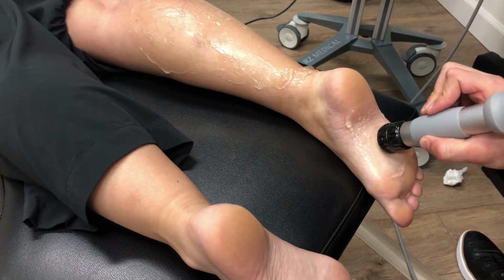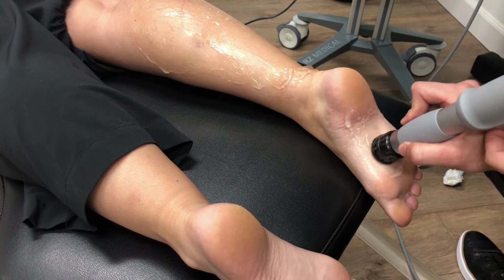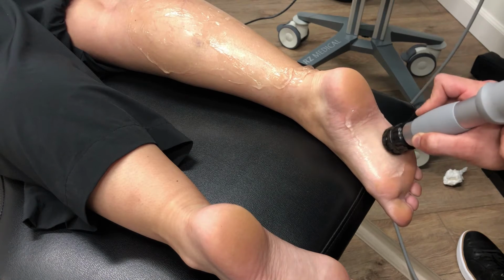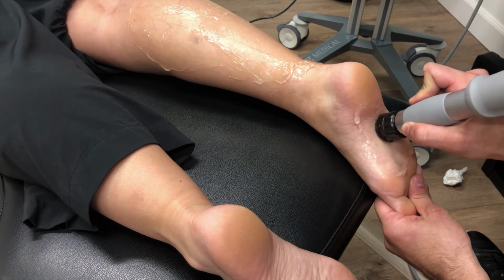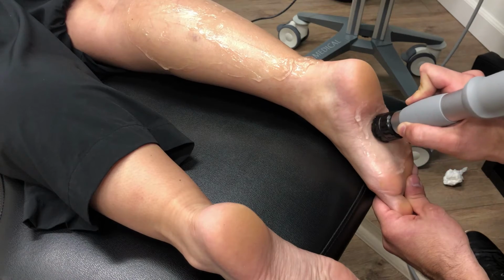All right, so now we're going to treat right into the bottom of the foot, into the plantar fascia and the small muscles of the bottom of the foot. And then once we get up towards the heel, we'll switch out the head. We're going to do a little bit more of a focused approach into that area. All right, Sarah, you ready? Doing okay?